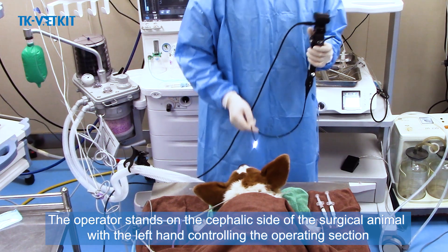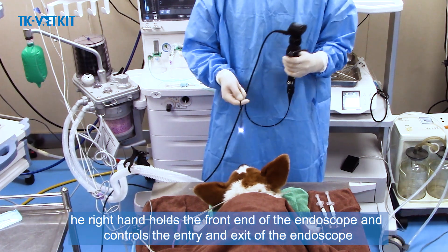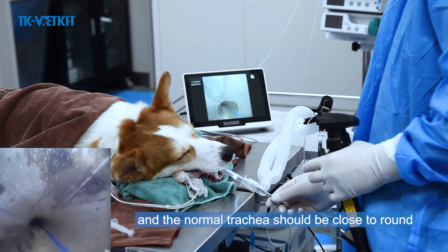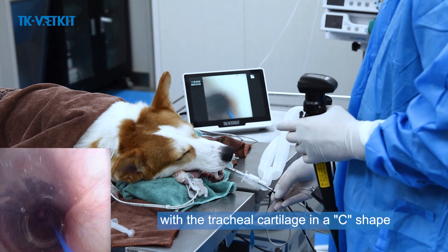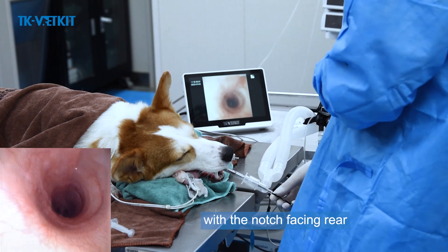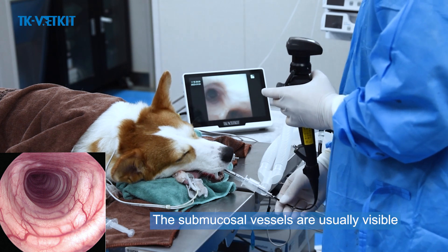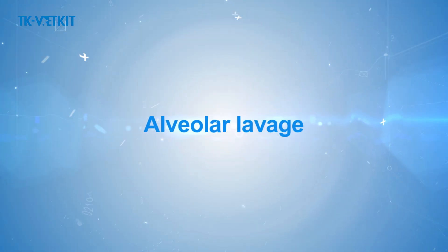The operator stands on the cephalic side of the surgical animal, with the left hand controlling the operating section and the right hand holding the front end of the endoscope to control entry and exit. The endoscope enters the trachea through the oral cavity. The normal trachea should be close to round, with tracheal cartilage in a C-shape accounting for about two-thirds of the tracheal circumference with the notch facing rear. The normal tracheal mucosa is smooth and light pink, with submucosal vessels usually visible but more prominent in inflammatory diseases.